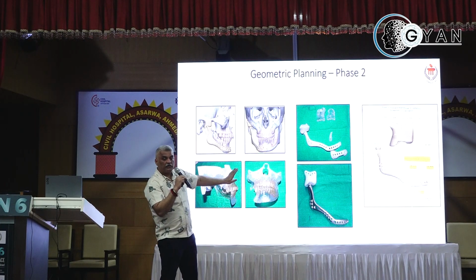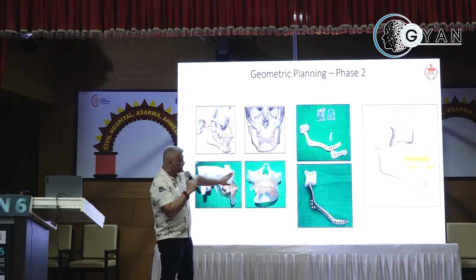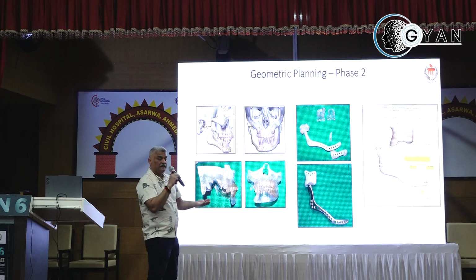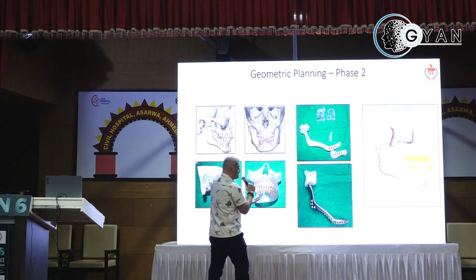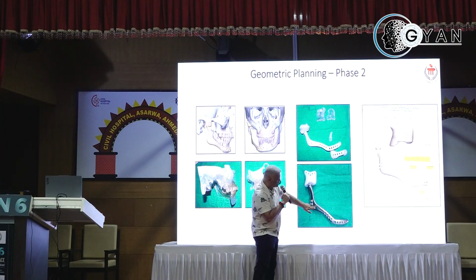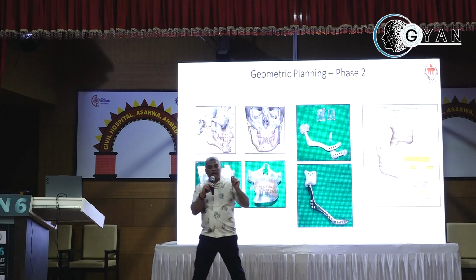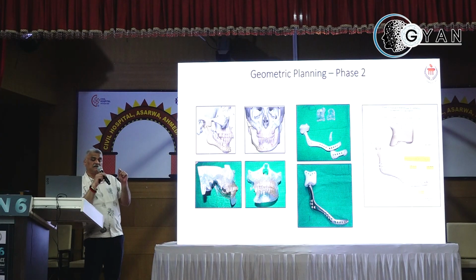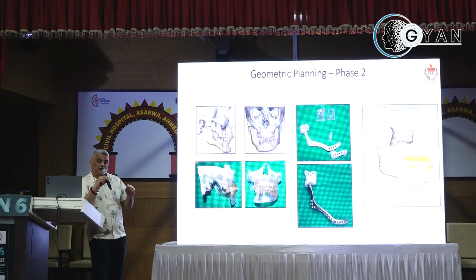Today, would I do this? I would never do this today because it's all metal and it does not have a cradle kind of bearing to hold bone in it. Only metal without bone is going to lead to a fracture exactly at the junction of the angle where the horizontal meets the vertical. This is an area of concern when you have extended TMJ TJRs. There is an excellent paper in the Journal of Oral and Maxillofacial Surgery, 2023 edition. Pramod, Subhash and Arjun have written this paper where they've used free fibulas along with custom TJRs.